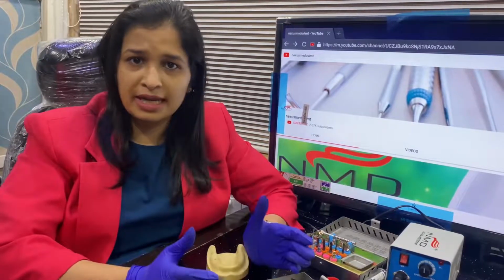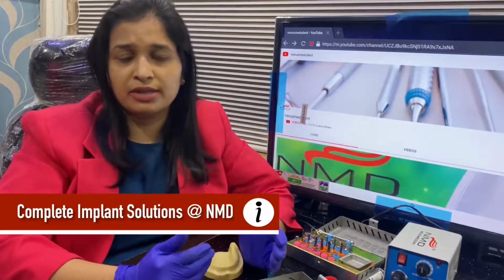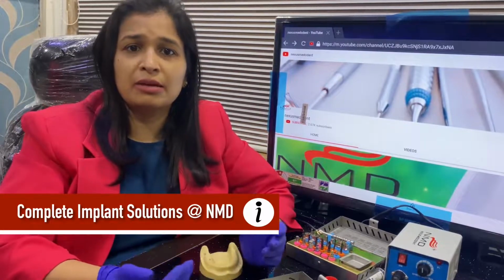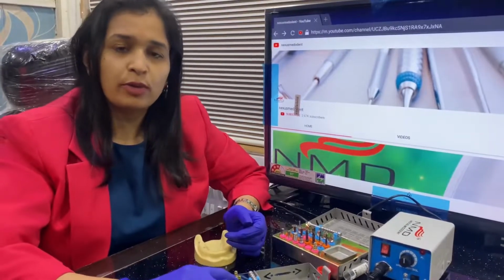So first I would decide my length, and also in the CBCT you will get an idea of how much width is there. Supposing you have a width of around 4 mm and you have decided that the length is around 11 mm, for example. If it is 4 mm, and you want to place an implant of 3 mm, you cannot do that. So that's when this kit will help you in expanding the bone. From 4 mm, you have to expand it up to around 7 mm, which you can do with this kit. So let's quickly go through the demo.